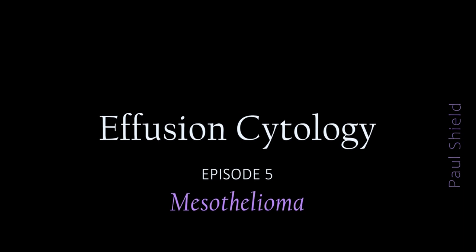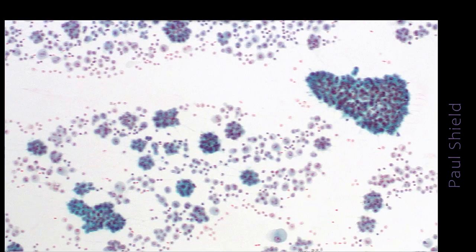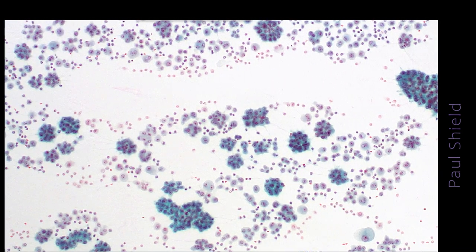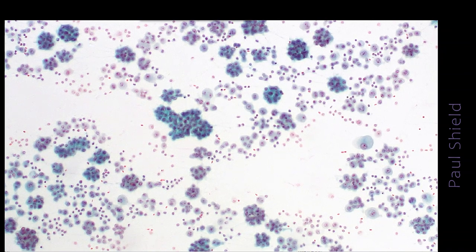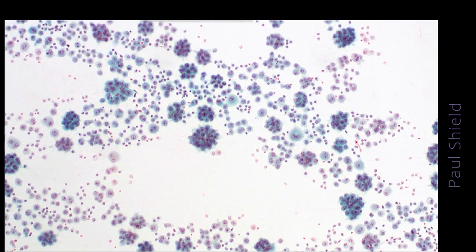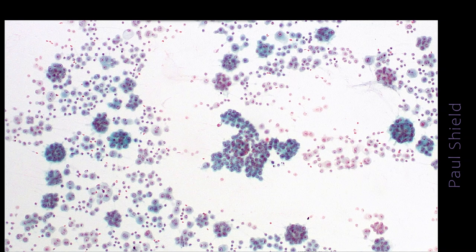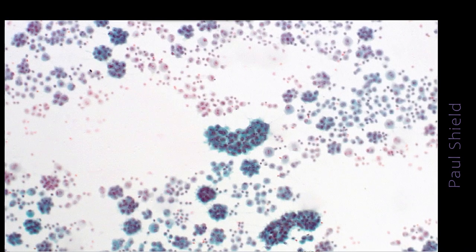What we're going to look at is the most common pattern, which is pretty much a well differentiated pattern of mesothelioma. Specimens are usually highly cellular, so looking down here I can see lots of groups, and notice they're slightly complicated. So this one's branching a little bit like a sort of X, and then lots and lots of balls of cells. So highly cellular, large groups of more than 50 cells. And notice how they kind of bent around as well.